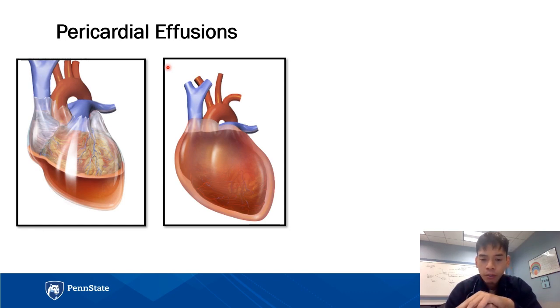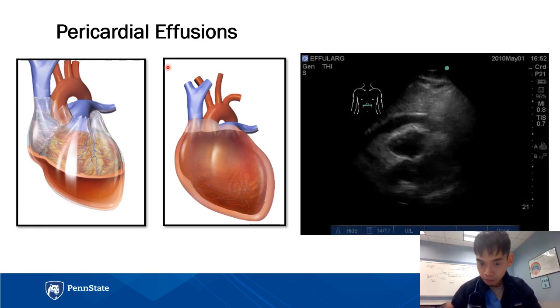And so the mainstay here is that we saw what normal pericardial subxiphoid ultrasounds look like. And can we identify this on an abnormal ultrasound? So let's say you have some patient that's hypotensive and looks diaphoretic and problematic, and you go ahead and do the first part of an eFAST exam. You place that probe right under the subxiphoid and you see this.